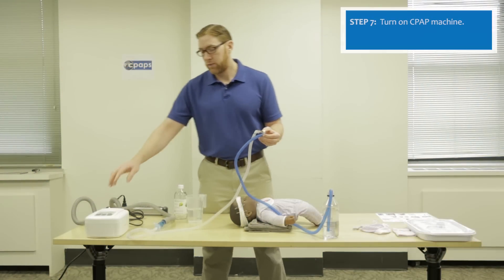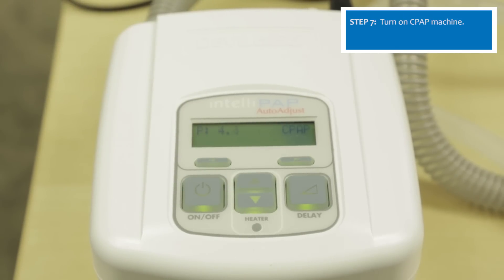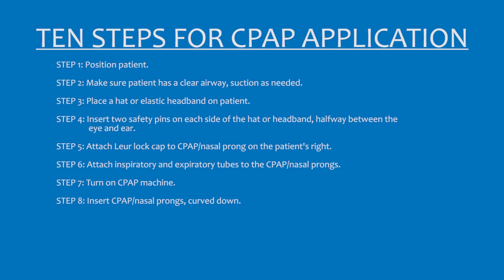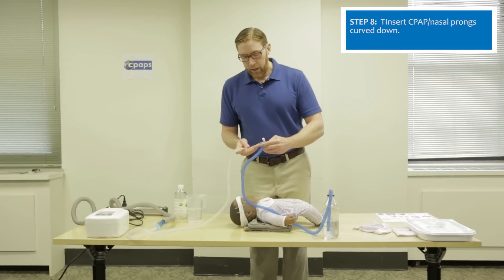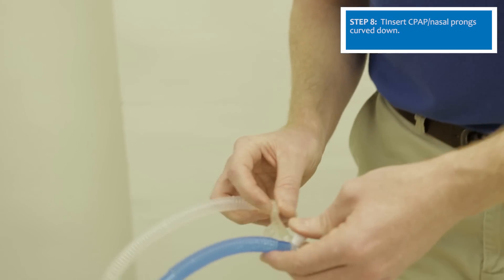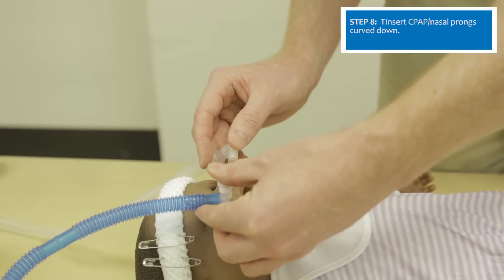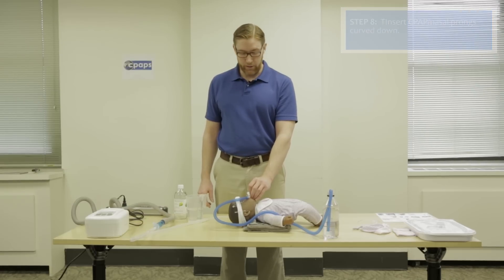Before placing the prongs, turn the CPAP machine on by pressing the on-off button and monitor that the machine goes to five centimeters of water pressure. Now apply CPAP to the patient. An important part of application is ensuring the prongs are inserted correctly — the CPAP prong should go curved down, posterior and inferior, as anatomically correct. The patient is now receiving five centimeters of water pressure via CPAP.